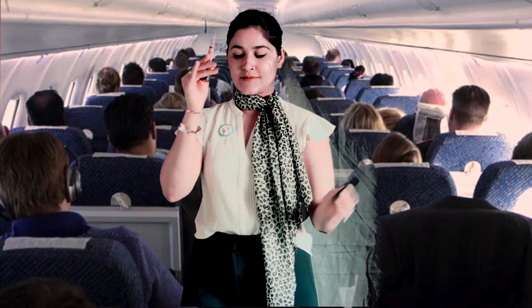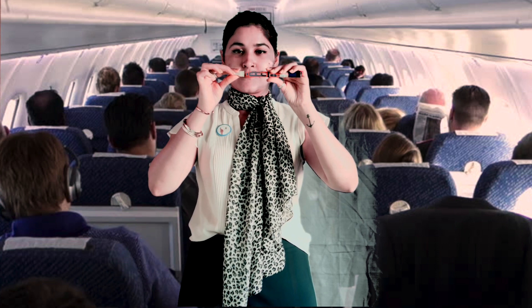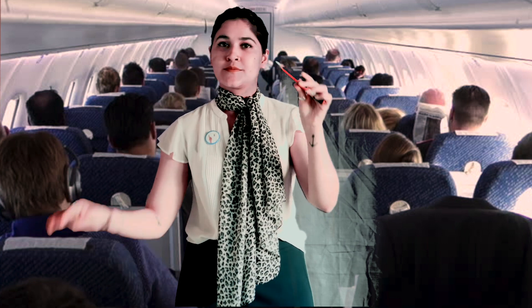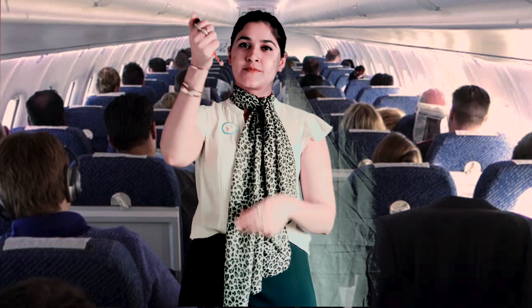Open the flex pen like this. To clean, use an alcohol swab. Insert the needle on top, twist to secure, and release the outer cap like this. Carefully remove the needle cap, dial 2 to 4 units, and inject slowly to prime.